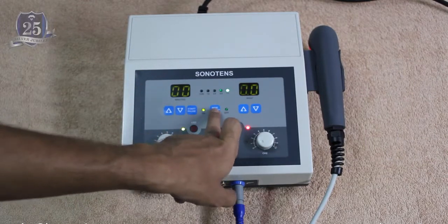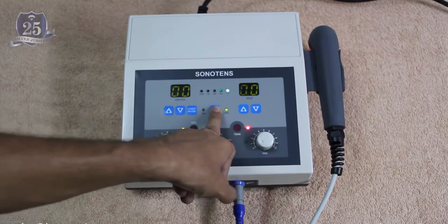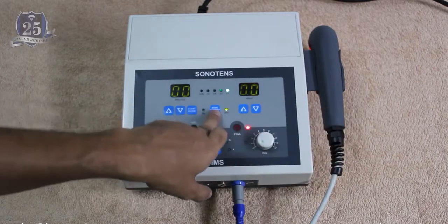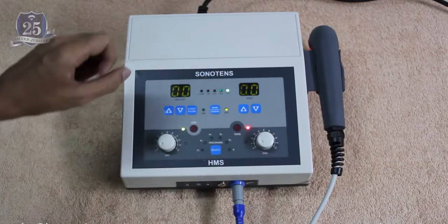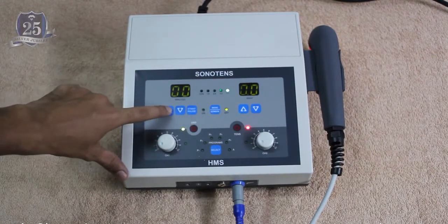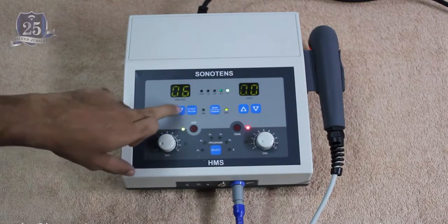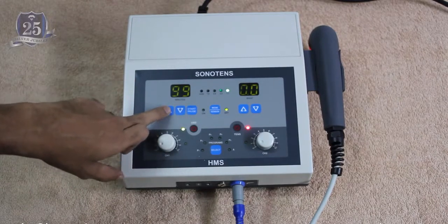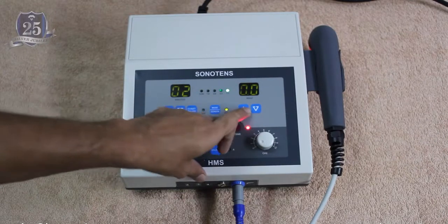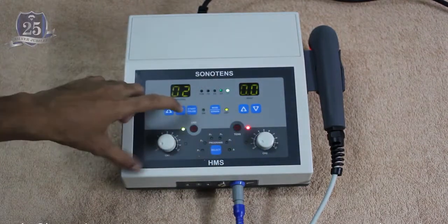So the middle button over here, the mode button, if you press this button for a long time, then you can disable the auto sensing feature of the transducer. So this feature is also available with the SONOTENS. Now we'll go through the key functions. So this key over here is used to set the timer for ultrasound. So the maximum time limit is up to 99 minutes, which can be set with the SONOTENS. And this switch over here is actually the intensity switch, which will start only after switching on the ultrasound.